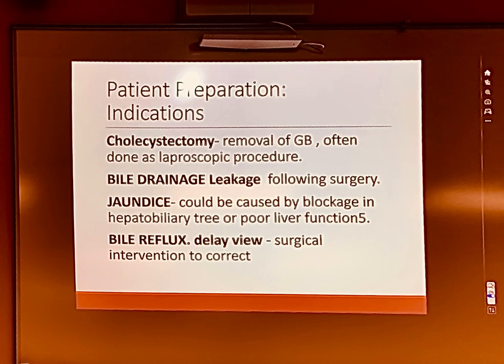Because again, we can acquire a dynamic image and they can watch it like a movie to see where exactly this bile goes. Does it follow the normal anatomical path of bile? And if it doesn't, that's how they know that it's a leak.